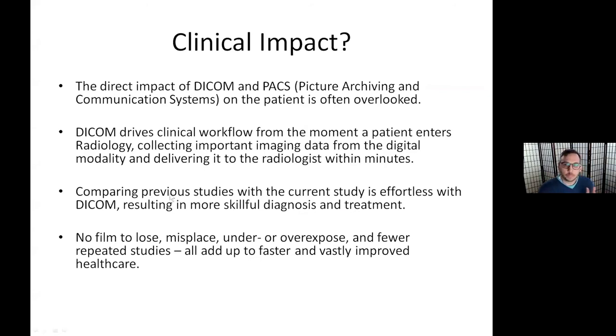And because it's digital, it allows us to compare easily across different time points. So we can see how the patient was 6 months ago and how the patient is today. And comparing those, we can get a differential diagnosis. What's changed? What's gotten better? What's gotten worse? And there's no film to lose or underexpose. It's all there at our fingertips.